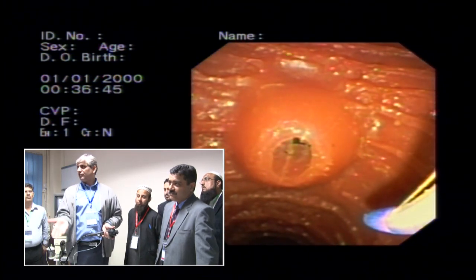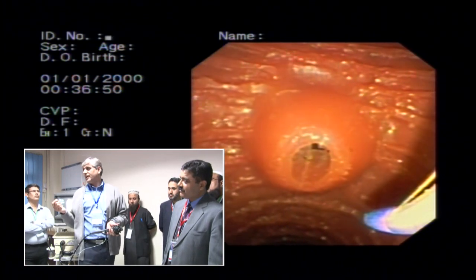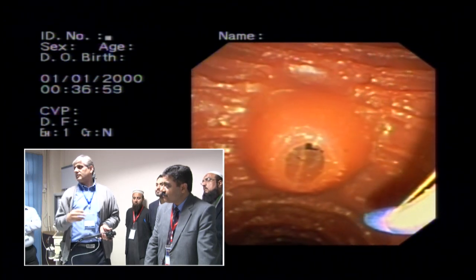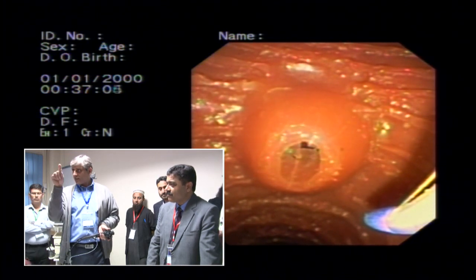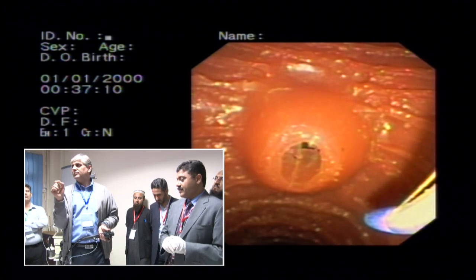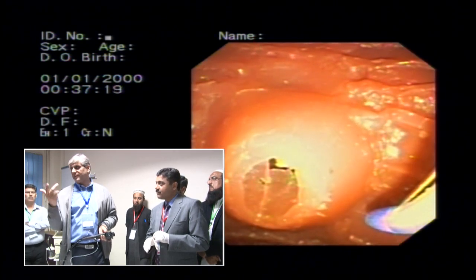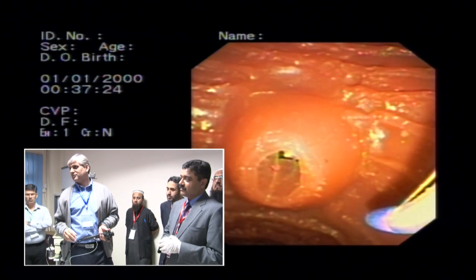Sometimes it's behind a fold, you need to lift fold, wash, make sure that it's clean. There's small एम्पुला है नहीं नज़र आ रहा उस वक्त बिकॉज उसको फोल्ड ने कवर किया है, start lifting every fold around that area rather than going in यहाँ पे भी और D1 में भी ढूंढ रहे हैं और हर जगह ढूंढ रहे हैं नहीं, stay where it's supposed to be and start lifting the fold, and quite often you'll find that it's under one of those folds. But it's time, patience and knowing what you're doing. His X-ray की position is very useful. I mean, you saw all the cases he presented, immediately you know that must be the correct position.